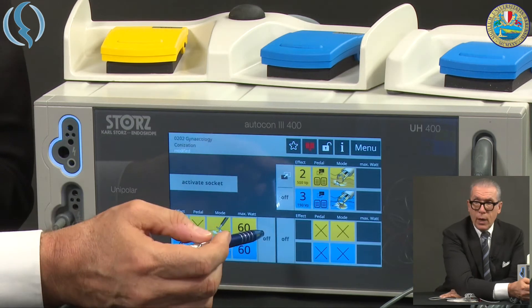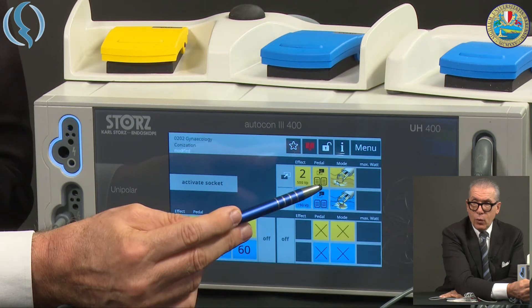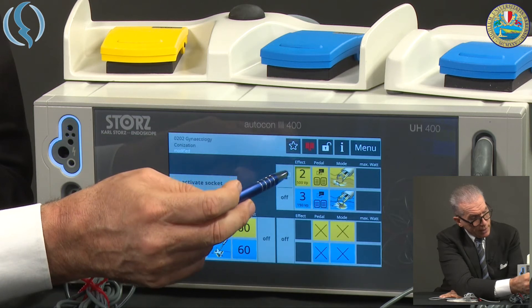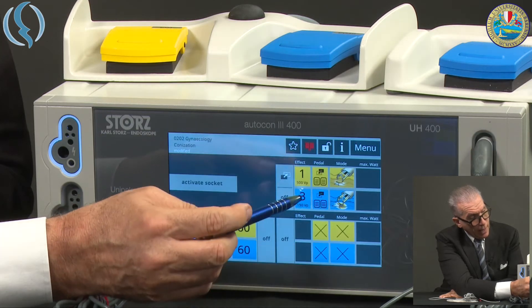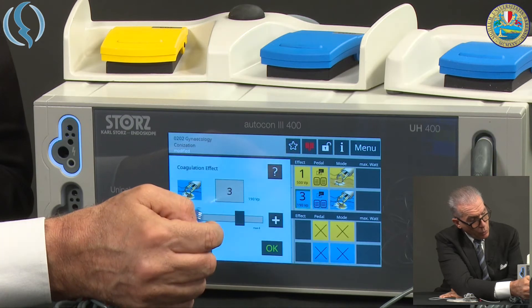I'll show you how the zap mode works. This is the standard setup for these instruments. I can even choose to reduce the intensity of the effect — instead of two, to one for the cut, and for the coagulation maybe to two.